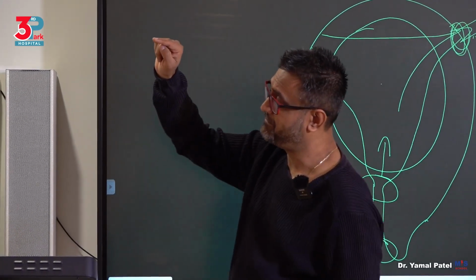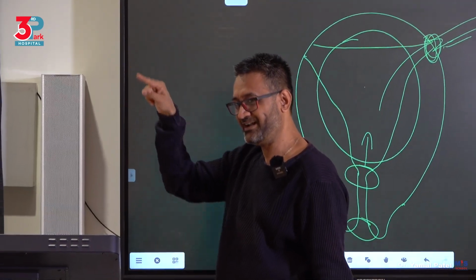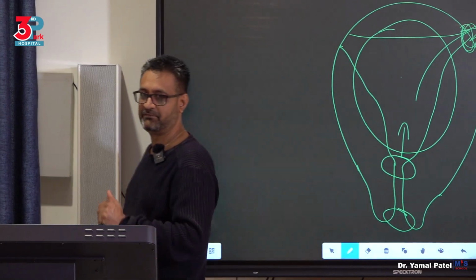And if you look at the monitor, it will give you the BP in the form of systolic and diastolic, but in the bracket, it will give you the MAP. So you work around those pressures. That's what I'm trying to tell you, okay?